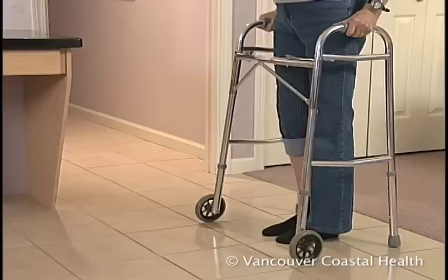As with the standard walker, press down through your arms, step into the walker with your surgical leg, and follow with your good leg.